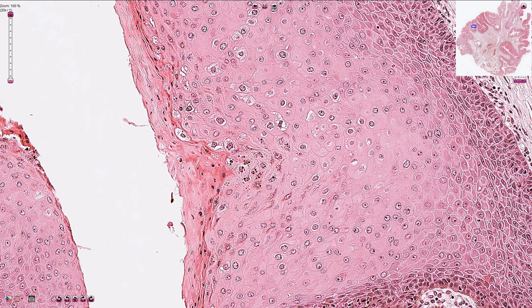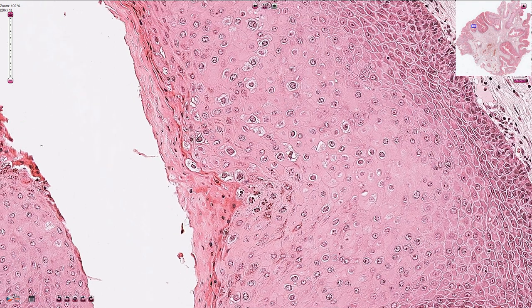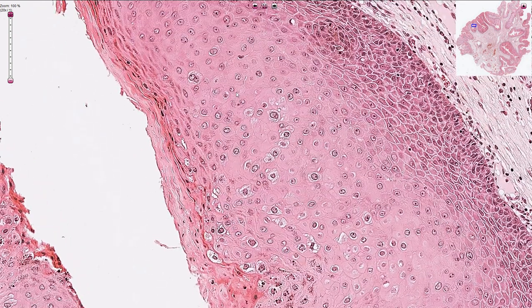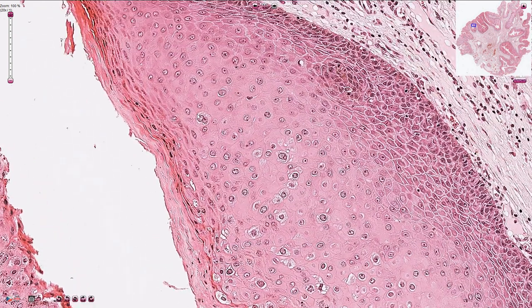The maturation in the epithelium is often disrupted, meaning that in layers closer to the surface we don't see small nuclei. The nuclei are still quite large and the cells look like they are from the basal or parabasal layers. However, the nuclear-to-cytoplasmic ratio is quite low and high-grade dysplastic features are not seen. Here we see typical binucleation — two nuclei in one cell — which is quite often seen in condyloma.